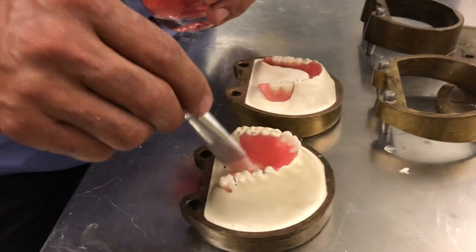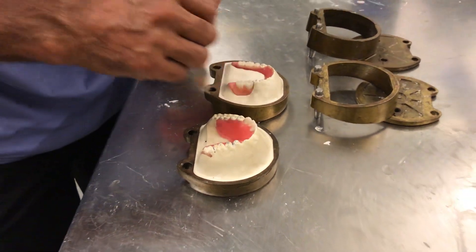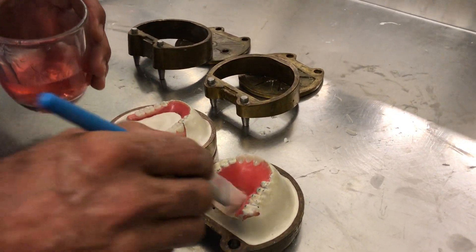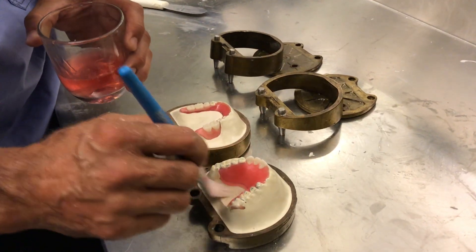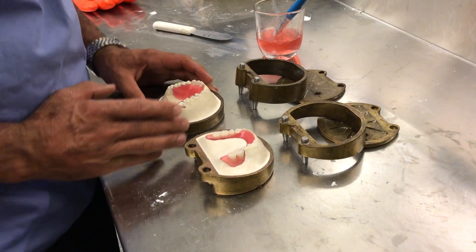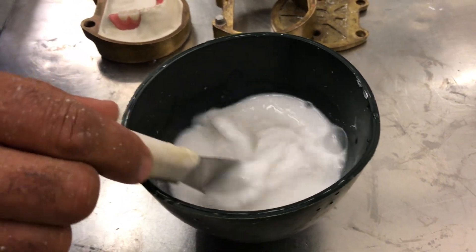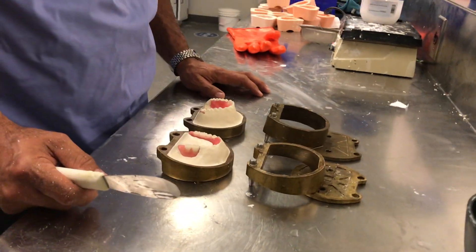Now for the second half of the investment — some videos show using a half-and-half stone and plaster mix, but I like to do it a little differently and just use regular stone to invest the teeth initially. Let that set — not completely, but go through its initial set for about 5 to 6 minutes, then top it up. I have some slurry water here that will allow the mix to set much faster so we can keep up with the video without breaking it into two parts.